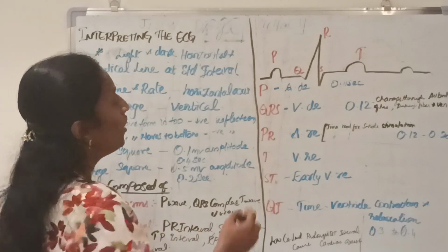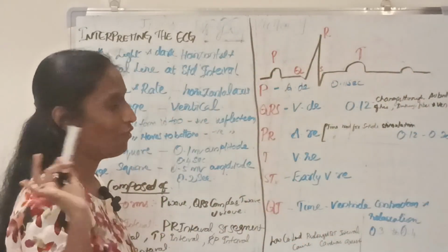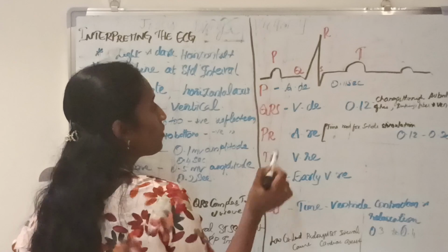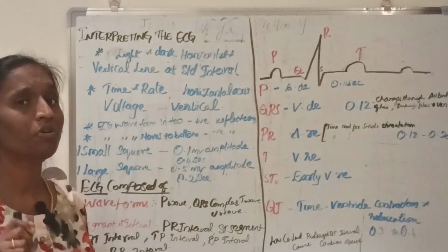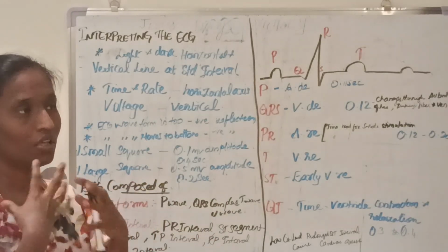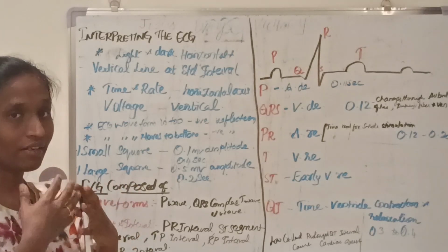So this is the graphical representation of the ECG of a person. In this, this part is called the P wave. Why is it happening? It is the atrial depolarization. The electrical impulses get activated, and the muscle cells react to the electrical ions.